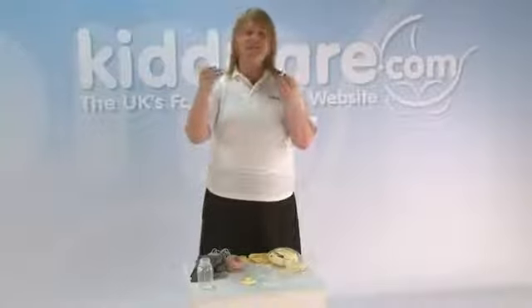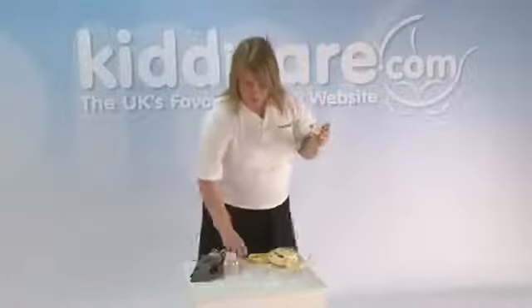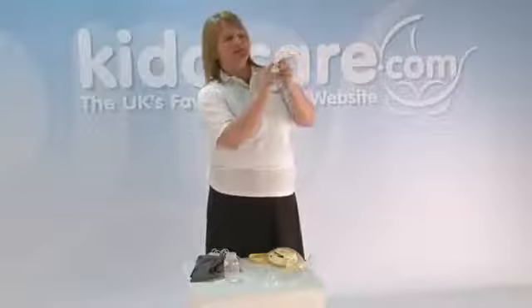To put it back together, you take the silicone. Once it's nice and clean, thoroughly washed, you can press here without touching the piece that's going to be in the baby's mouth. And you push that onto the part with the bumps. What we need to do now is flick down the edges of the silicone so they fit underneath the ridge. And then you'll notice there are 3 prongs underneath, and this part has 3 holes. So you literally just push those together. And then Calmer is ready to either be fitted onto the bottle or its protective lid put underneath for transport.